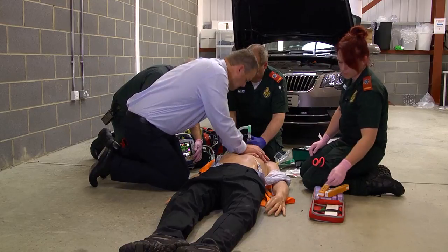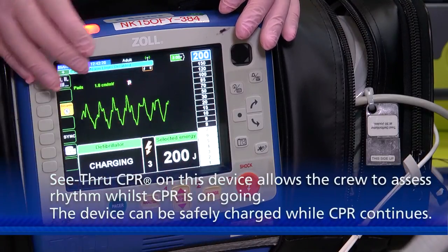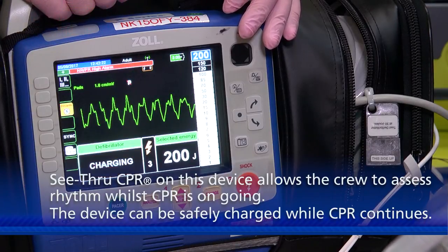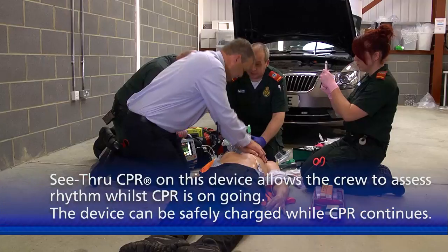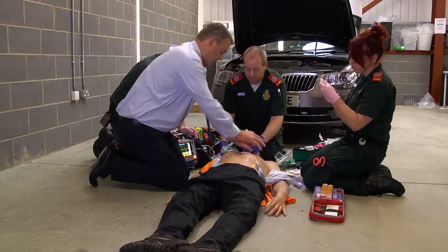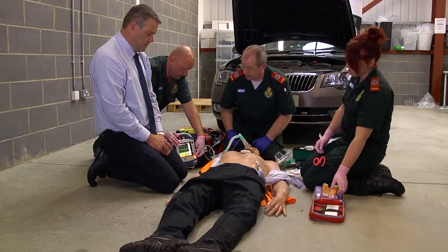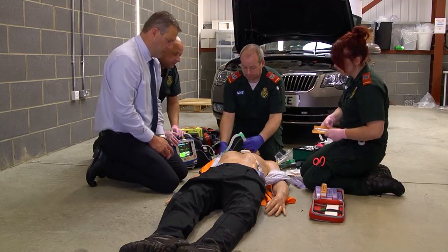I'm going to pre-charge, okay? Third shock, 200 joules. And then when you're ready, we'll have a look. Okay, it's perfectly safe, Jamie. Don't worry. So, Jamie, when I tell you, just stop CPR. Okay, stop there now. And VF, everybody clear? Yeah. And shock. Shock delivered, straight back on the chest, please.